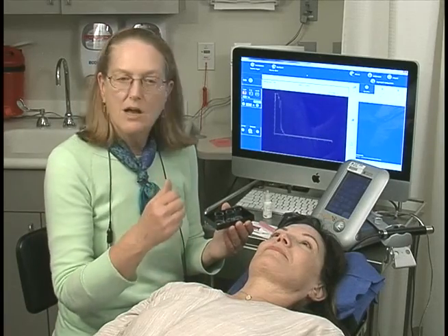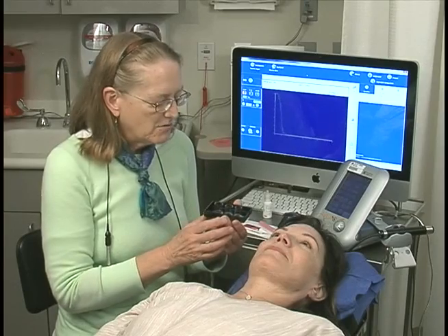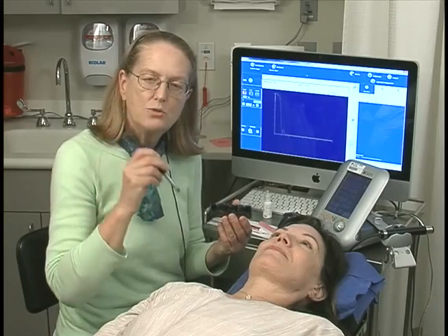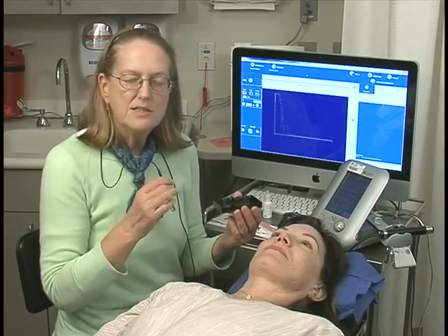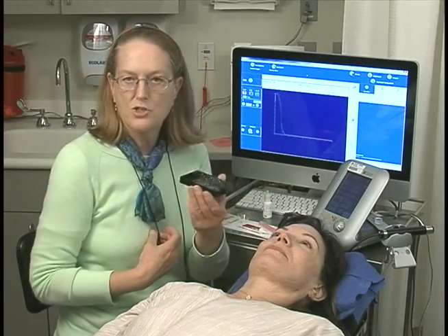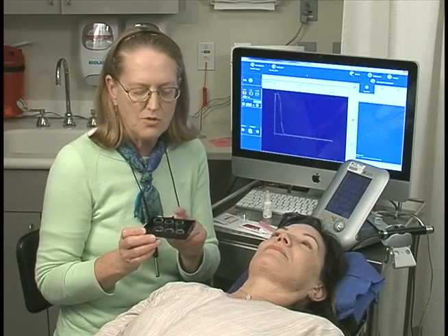The scleral shell rests on the sclera and it's filled with fluid. They come in a variety of sizes. There are also several different designs where the probe is actually mounted and fixed to the shell — that's called a fixed standoff immersion shell. In this case, I'm just using a traditional A-scan probe and the traditional immersion shells, which come in a variety of sizes. Shown here are three; they are larger and smaller.